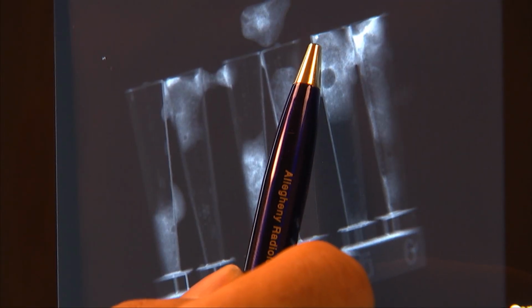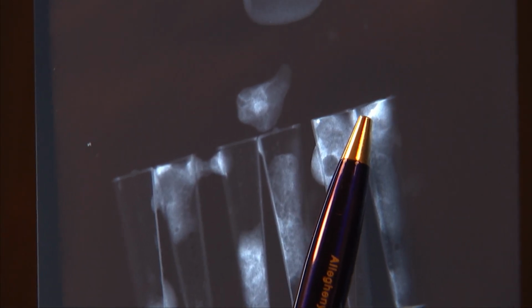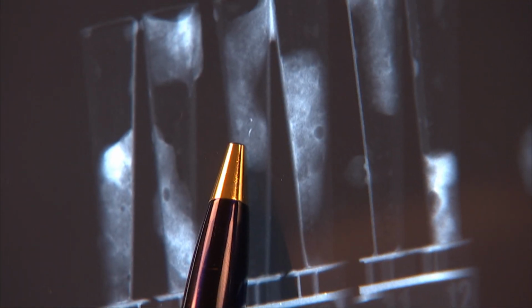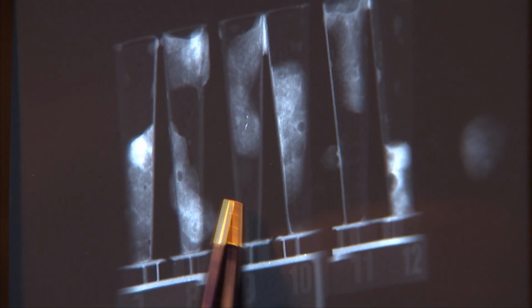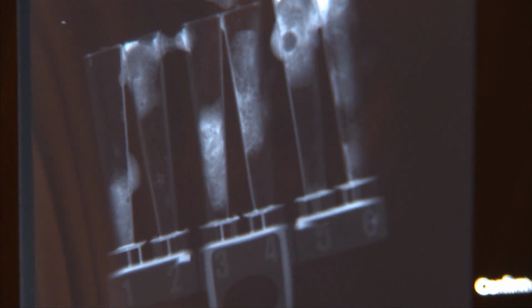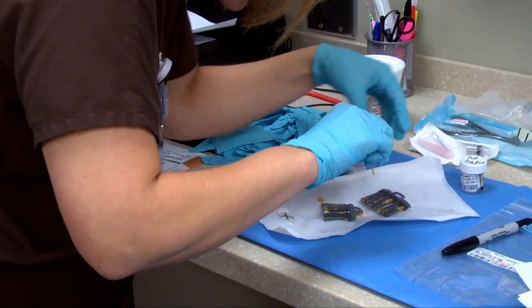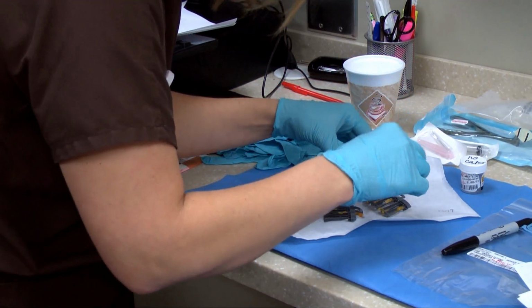And you can see on specimen number 5 and specimen number 6 and in specimen number 9 there are these linear calcifications. So it's pretty easy now for us to take the specimen out of the container, out of the slot. We know 5, 6, and 9, and we separate our specimens into calcifications, no calcifications, and we don't have to handle the specimens. The specimens are separated into containers marked with calcs and with no calcs.